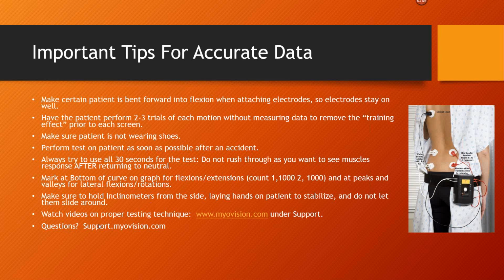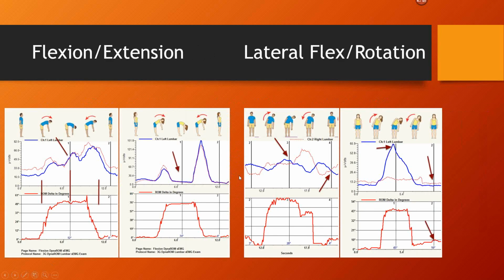Now, to understand how to do this properly, go to myovision.com under support. You'll see videos on how to perform the test properly. And you can always go to support.myovision.com for any other questions you have on how to do things. There's a lot of support information there.